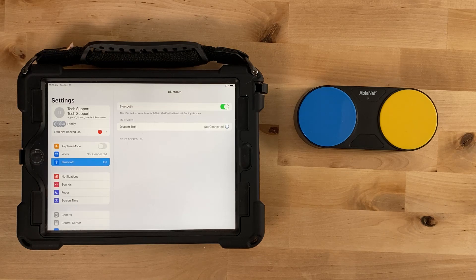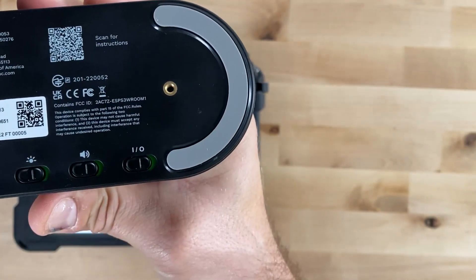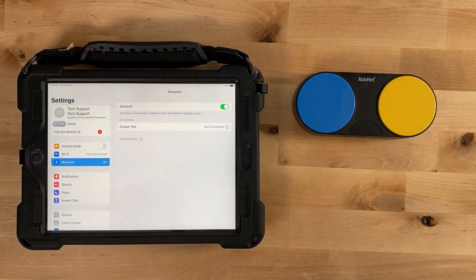Next, turn the Bluetooth on. When Bluetooth is turned on for the first time, the status indicator light will flash blue on and off for approximately one minute, indicating that Bluetooth is in pairing mode.